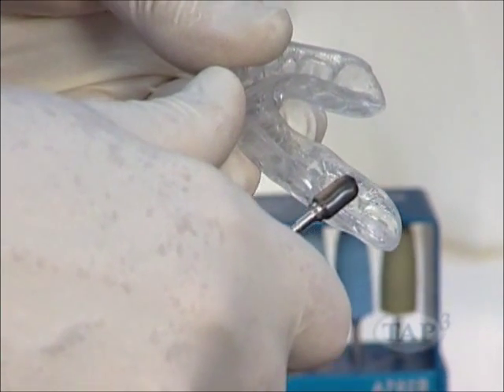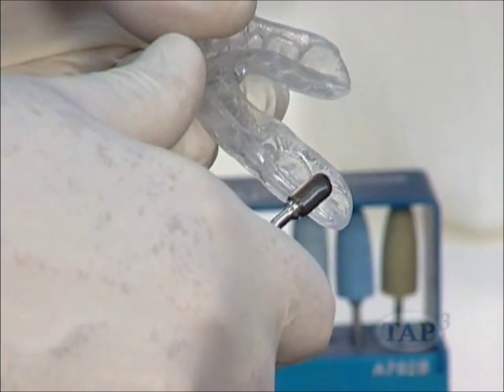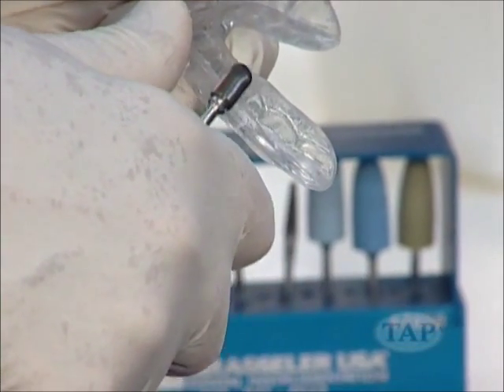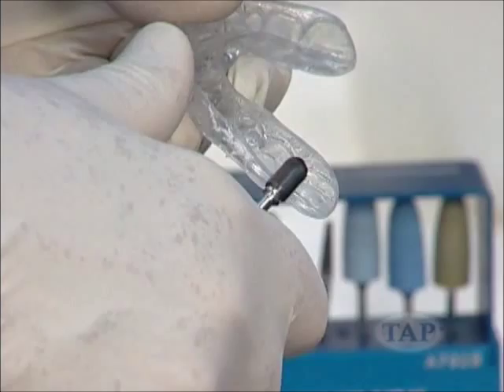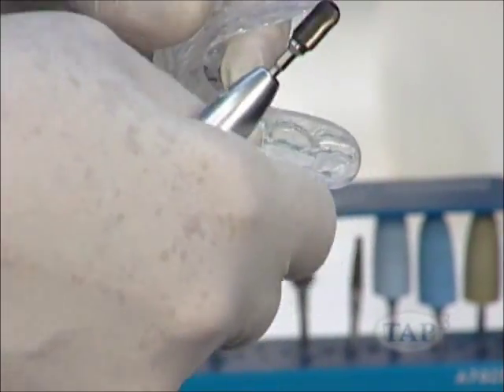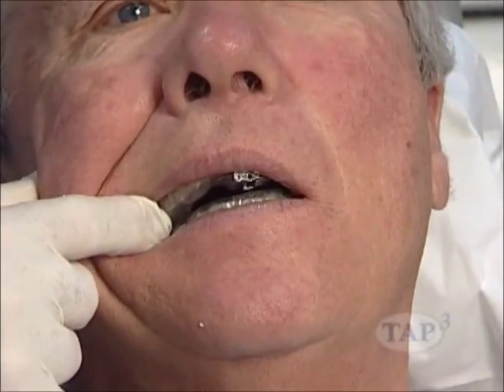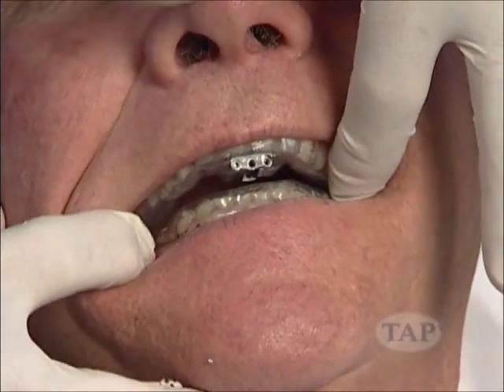To adjust retention, reduce the height of the flanges covering the teeth. Do not adjust the lining of the tray. Adjustments should be very slight. Fit the tray in the patient's mouth with each adjustment to avoid over-adjustment.